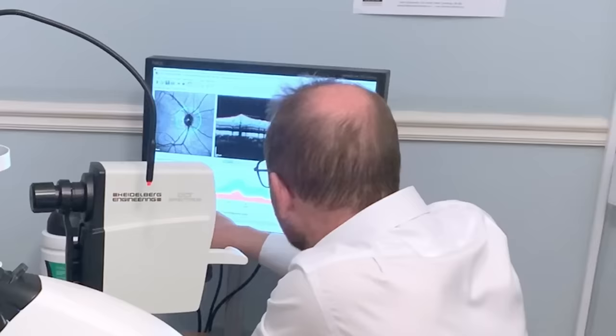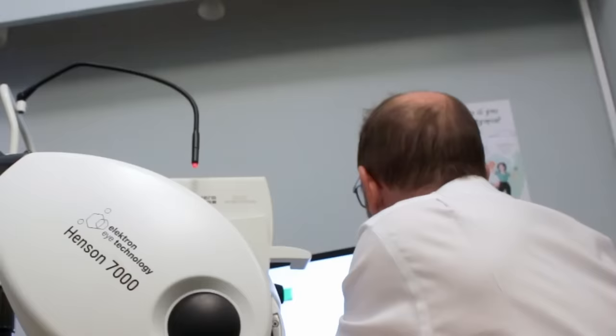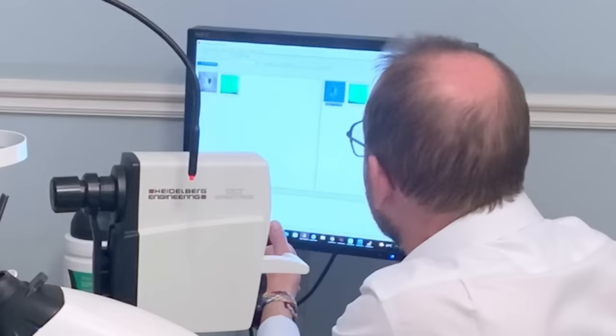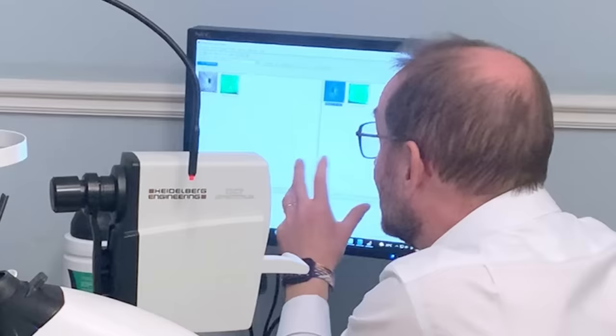Then we've got your other eye here, which is the same again. That looks really good as well, and all within normal limits. So that's great. Actually, equal on both eyes? Yeah, ish. Not always.